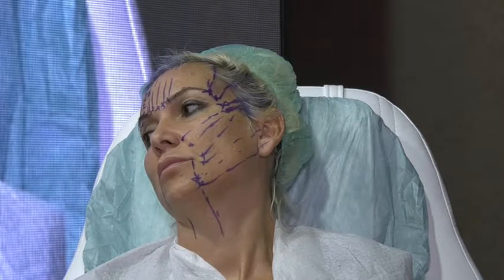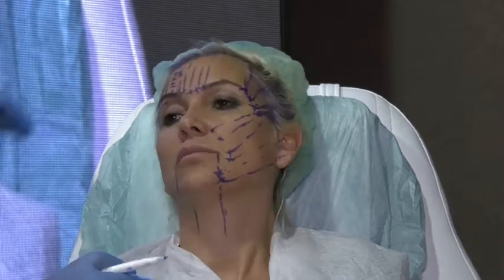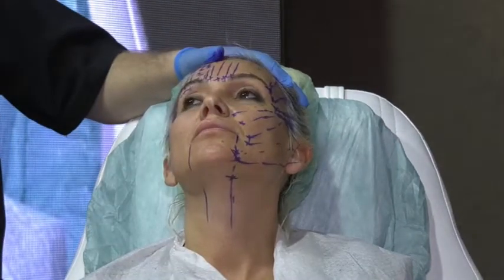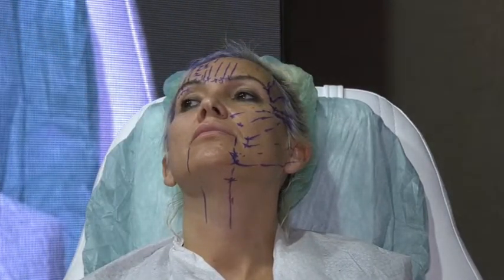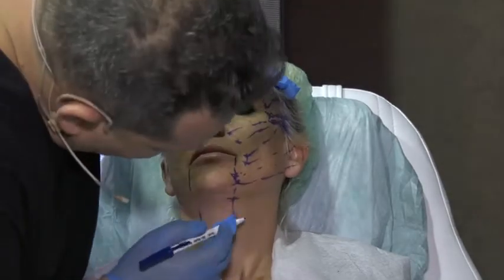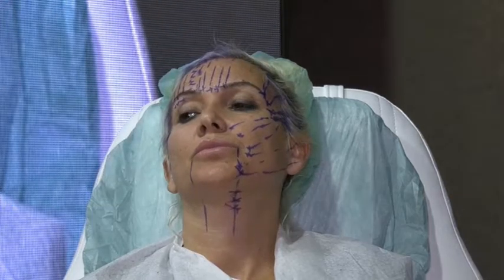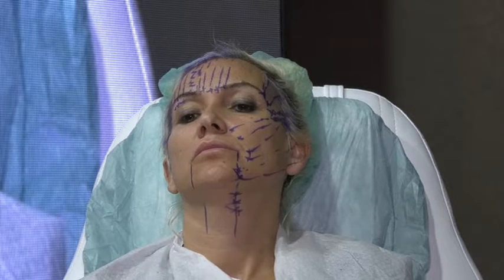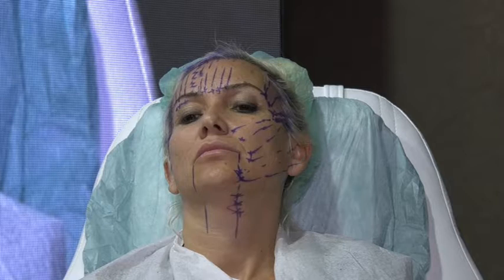So we'll now do the marking for zone number 4. Just under that, we choose where the laxity area is. By the way, she doesn't have laxity in the neck, but we are just marking. Next, 2 and 3. Do I have a limit? No limit, I can put 4, 5, 6, 7, 8. But do we have a limit anatomically not to go below?